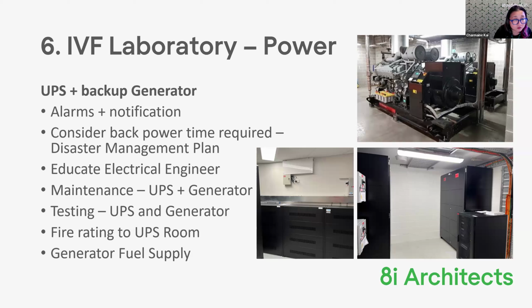Generally, as a rule of thumb, I would suggest an absolute minimum for a UPS power requirement of nothing less than 4 hours. I have had clients who wanted less simply because of the cost of the UPS, but the cost of losing embryos is a lot more than the cost of installing a UPS.